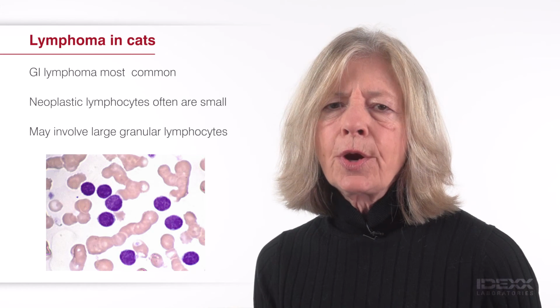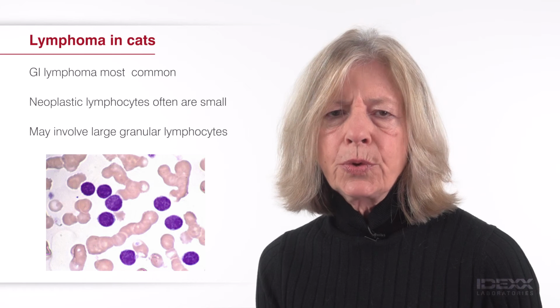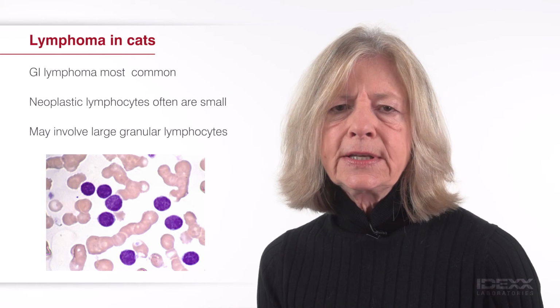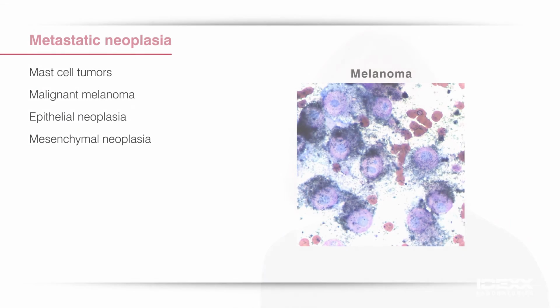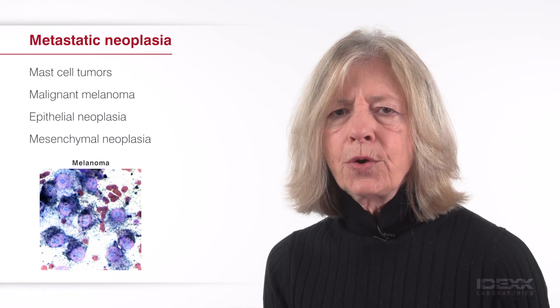These granules usually are prominent when stained with Wright stain, but may be less apparent with commercial quick stains. The significance of immunophenotype and prognosis in cats with lymphoma is unclear. Lymph node aspirates sometimes are evaluated for evidence of metastasis from mast cell tumors, melanomas, histiocytic sarcoma, carcinomas, and sarcomas.